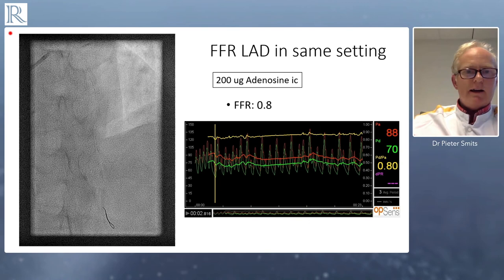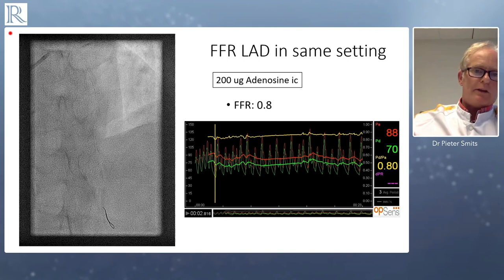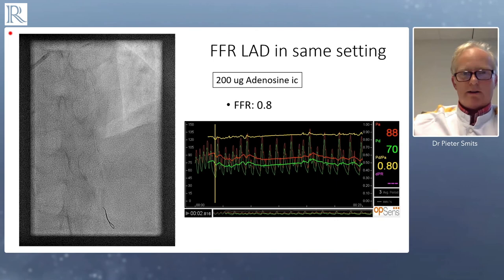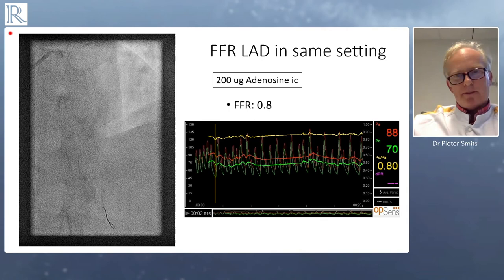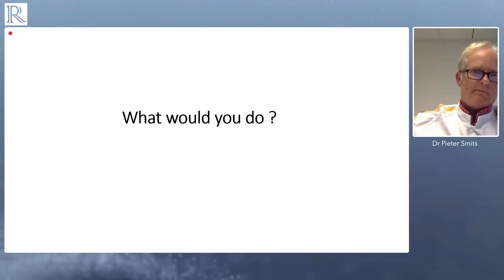Then we proceeded towards the LAD. You can see the wire in the cranial view, and in this case the FFR was borderline 0.80. That really is — then you could wonder: what should we do? This is borderline. Should we investigate more? What would you do?